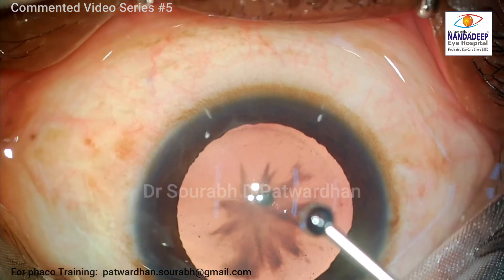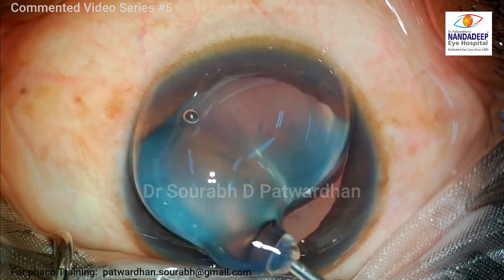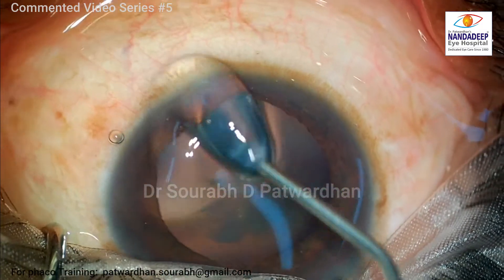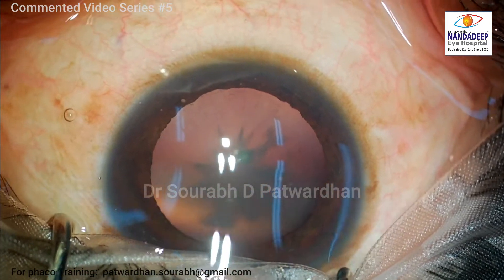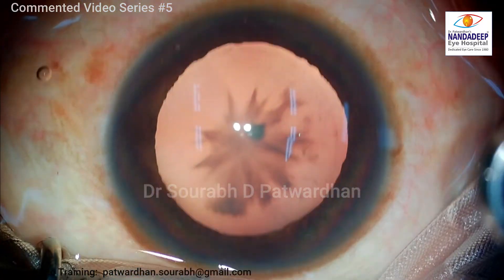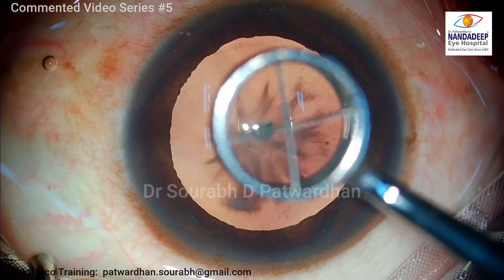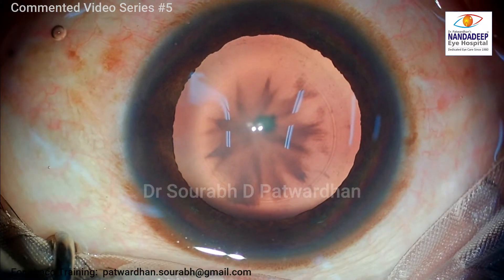Young patients are generally more anxious, and when you start off with topical phacoemulsification on such patients you have to reassure them during the surgery. The first thing they have is the issue of bright light, so they have to get used to it. I spend the first couple of minutes for them to just get used to the bright light and they adapt very well.